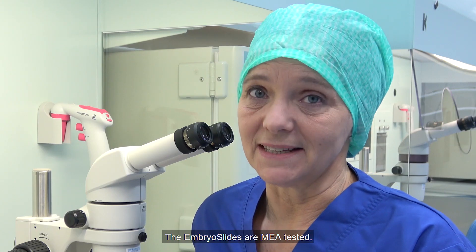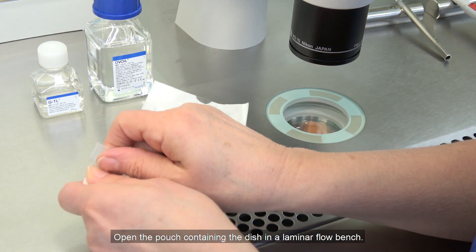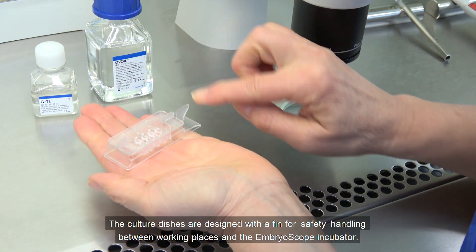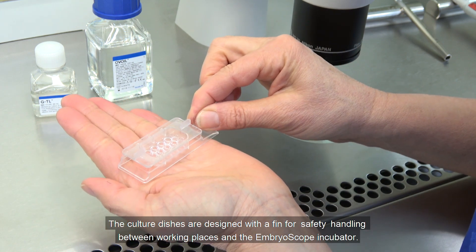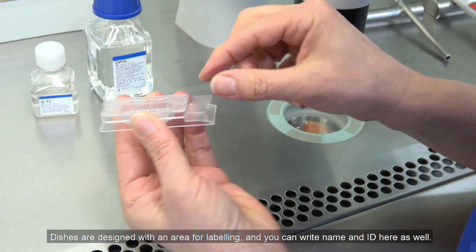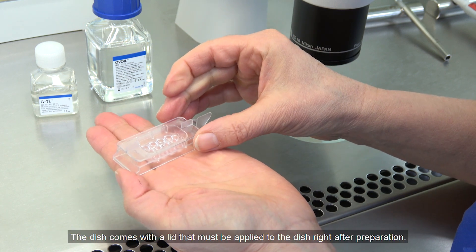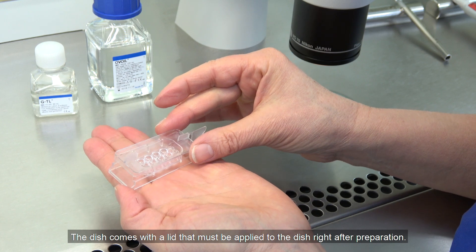The embryo slides are mouse tested. Open the pouch containing the dish in a laminar flow bench. The culture dishes are designed with a fin for safe handling between working places and the EmbryoScope incubator. Dishes are designed with an area for labeling, and you can write name and ID here as well. The dish comes with a lid that must be applied to the dish right after preparation.